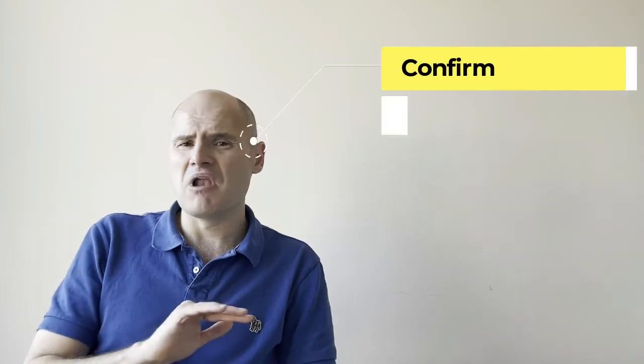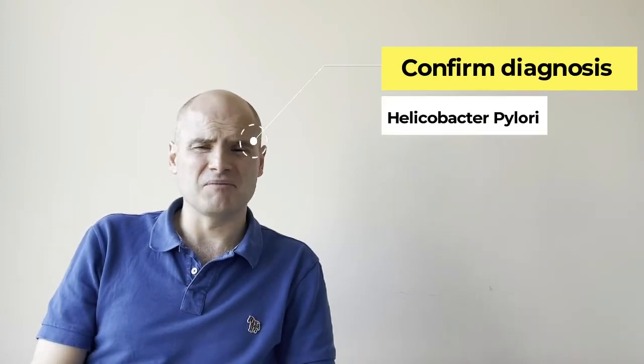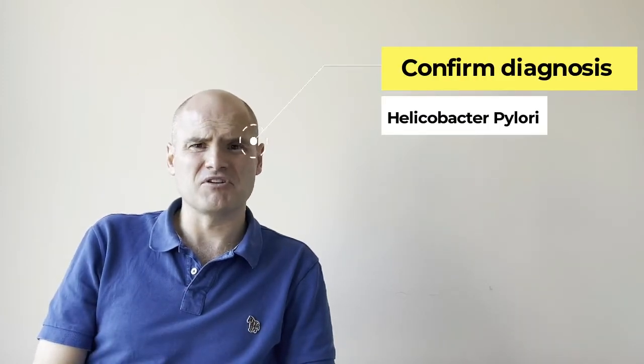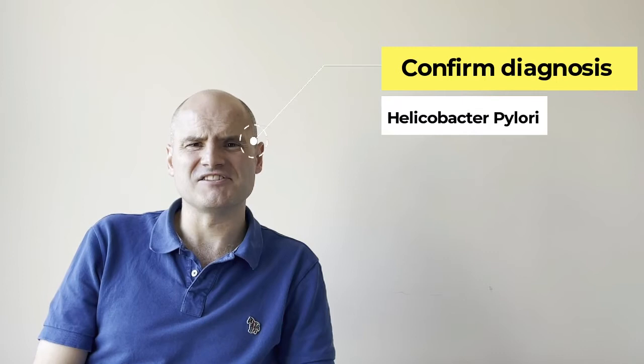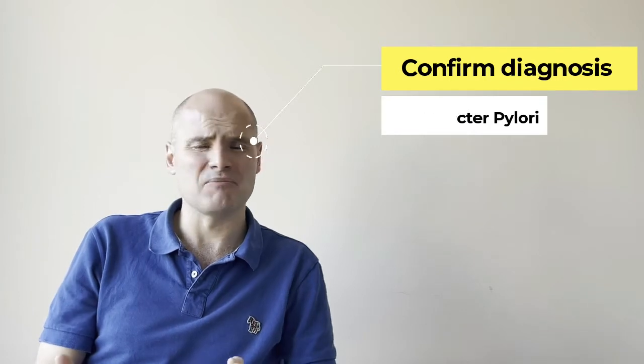The second time you need to take a biopsy in the presence of gastritis is if you want to confirm or refute the diagnosis of Helicobacter pylori. All other reasons to take a biopsy in the stomach really are unnecessary, unless there's something abnormal of course you see you need to confirm.